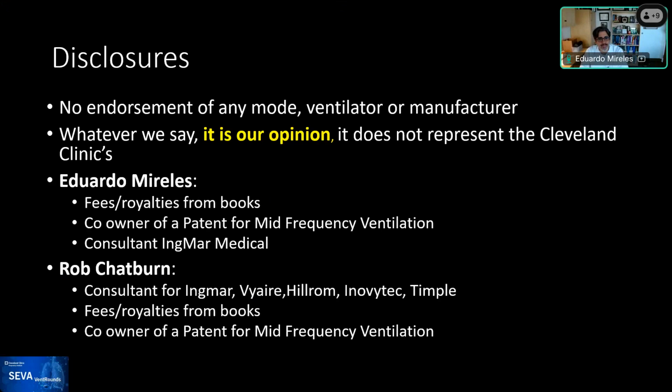Yeah, and the other one is to grab the card, get the ventilator, go into a room, connect it to a test lung and then see how it interacts. That's another way to do it, separate from a patient.